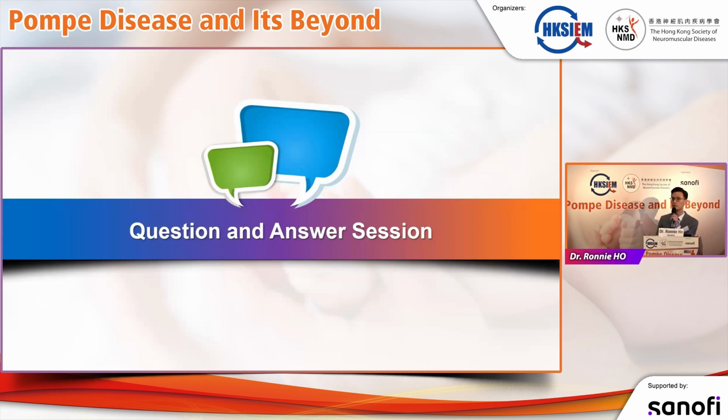But personally, I think it will be very difficult to interpret because there are various levels of enzyme deficiency. So it will be difficult to gauge the staining intensity, when to say it is deficient. Even if you do a staining on a clinically normal muscle biopsy, I think you would need lots and lots of normal controls to do that. So I don't think it's a good way to diagnose this disease, and therefore it's probably not really explored that much in the literature.